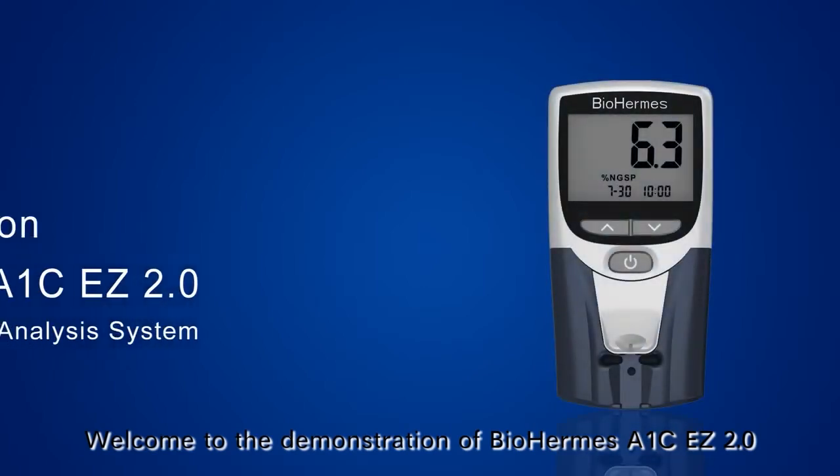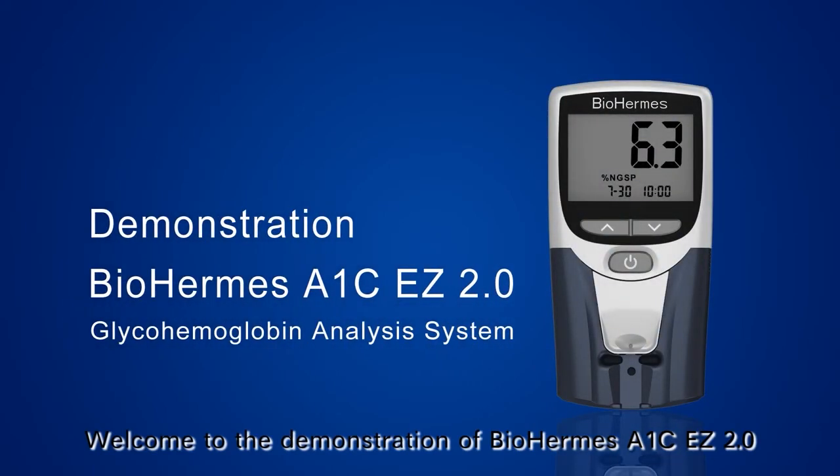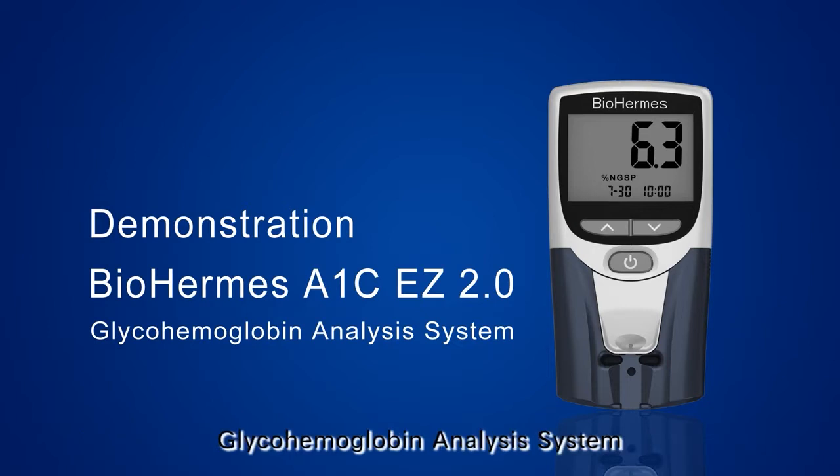Welcome to the demonstration of the BioHermis A1C-EZ 2.0 GlycoHemoglobin Analysis System. The system can provide you accurate HbA1C results with portable testing.